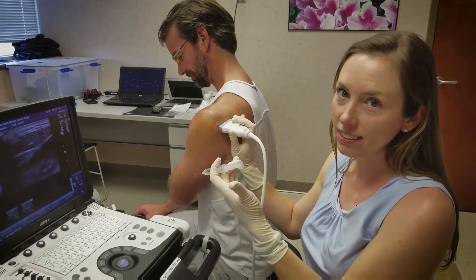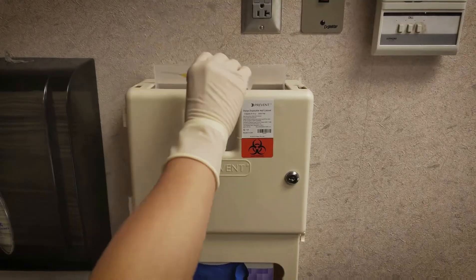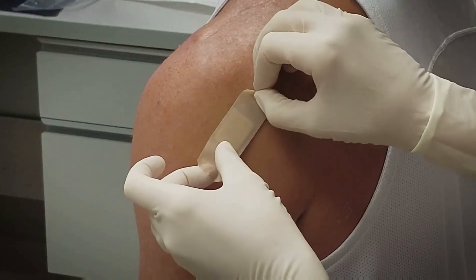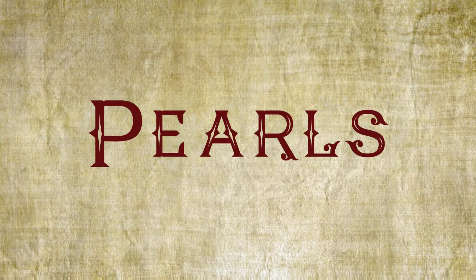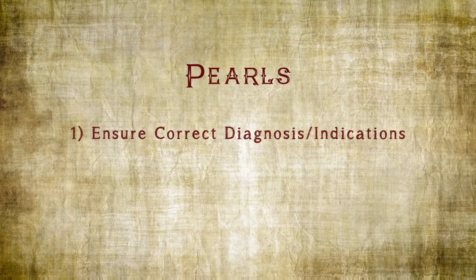Withdraw the needle, dispose of it properly, and cover the area with a clean bandage. In order to ensure the best chance of success with the procedure, number one, make sure that you have the proper diagnosis and correct indications for the procedure itself.